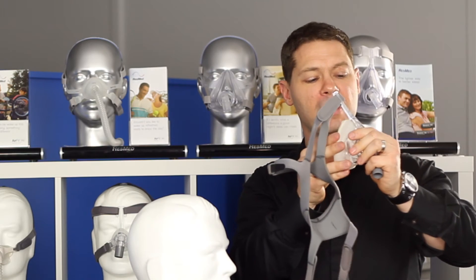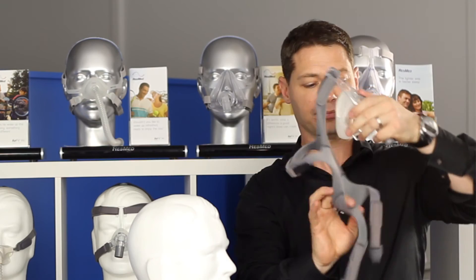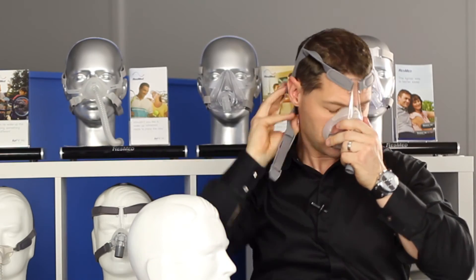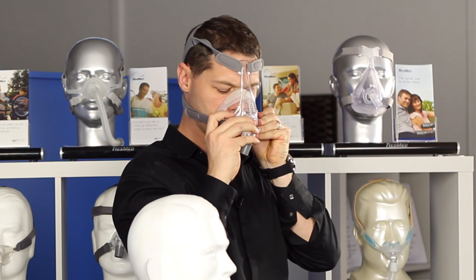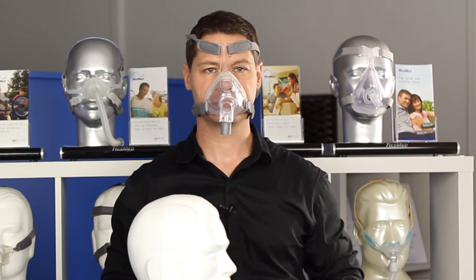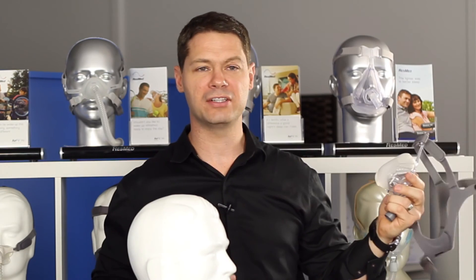So it's about finding the one that works the best for yourself. That clips on there, and it's very easy to take on and off, and also to clean.